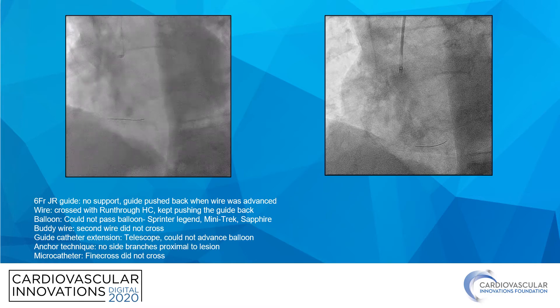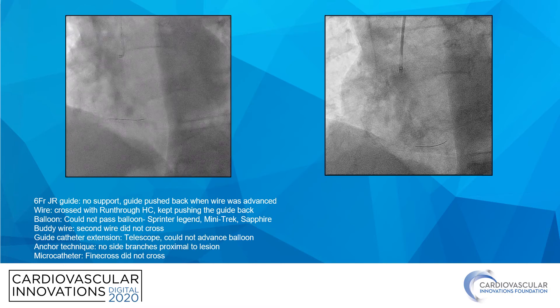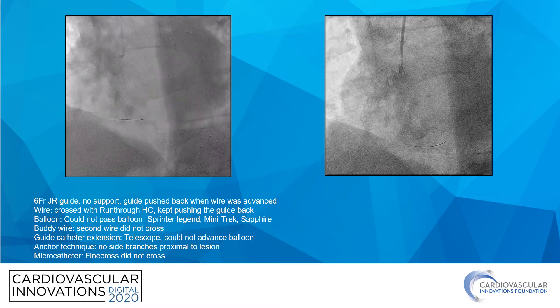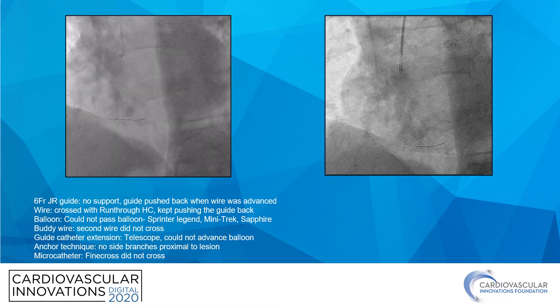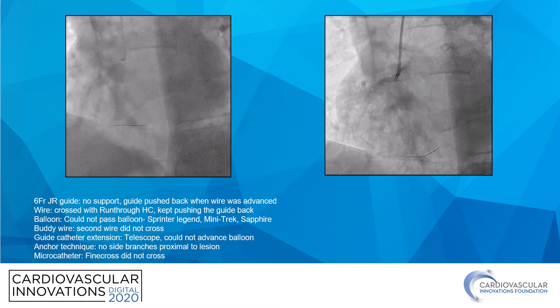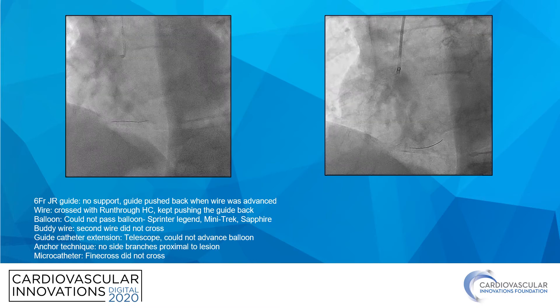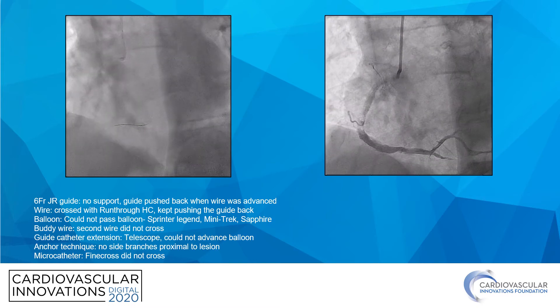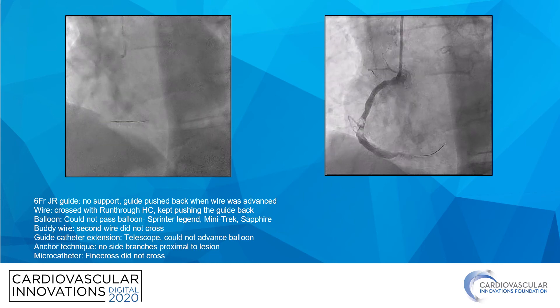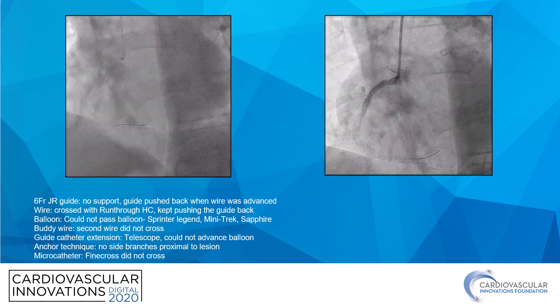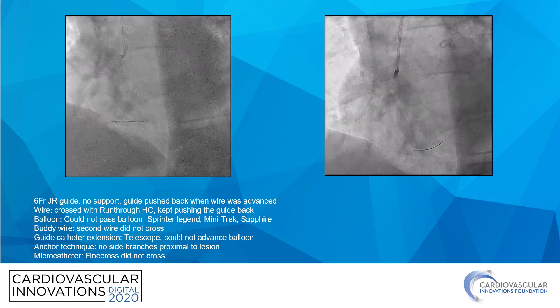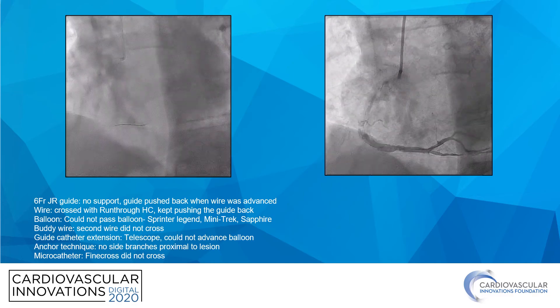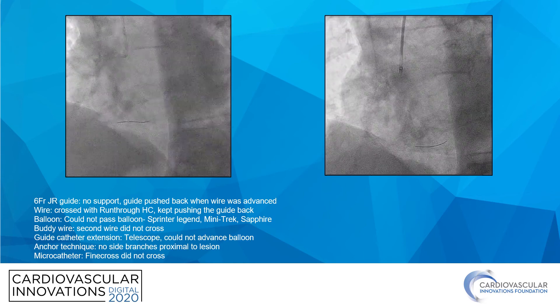I could not use the anchor technique because there were no side branches proximal to the lesion, and tried a FineCross which would not cross and was pushing the guide out. At this point I decided to stop and exchange my guide to a more supportive guide. I used an AL.75, and you can see it's sitting nicely with back wall support. I then tried the rota floppy wire, and with some difficulty I was able to cross the lesion and put the wire in the distal artery.